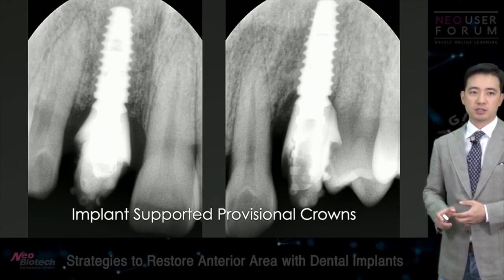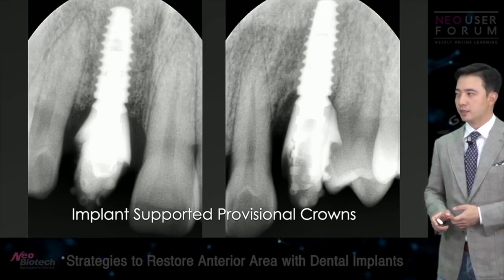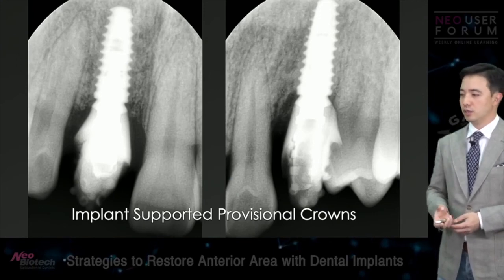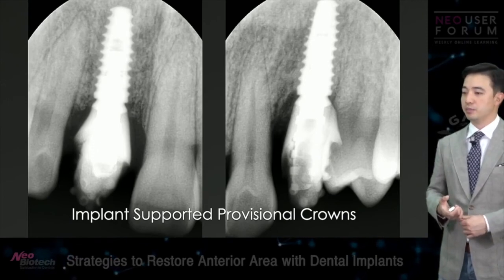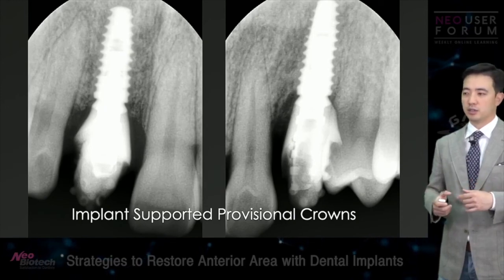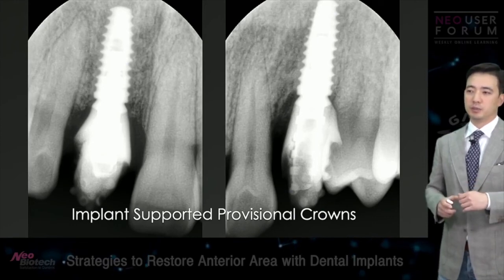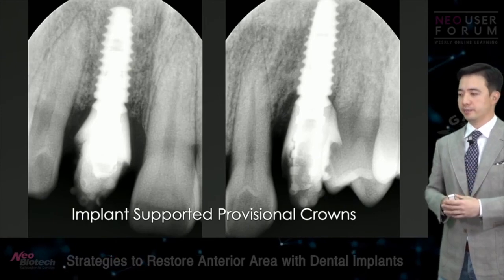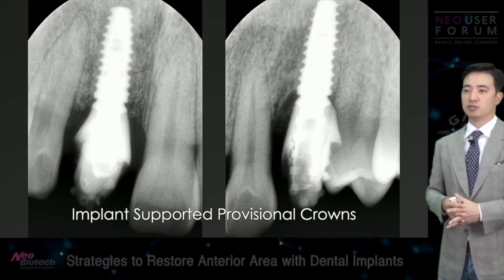So Dr. Christopher Sim asked this question. I think the question was about the third case that I showed you. The reason why I use the socket shield technique is because I believe it best preserves your soft tissue or hard tissue profile, because you're not extracting the buccal part of the root. It's the most minimally invasive condition that you can imagine, right?